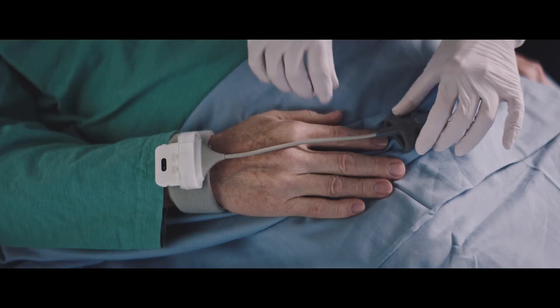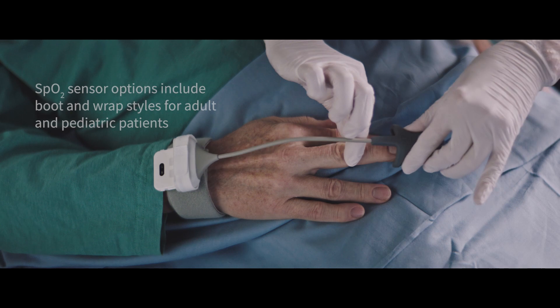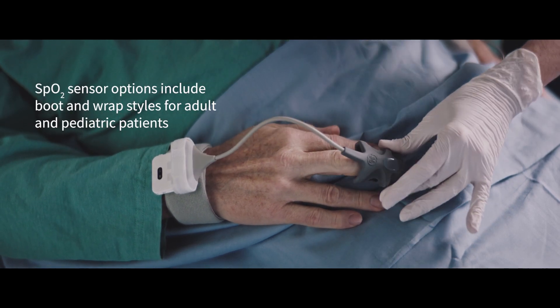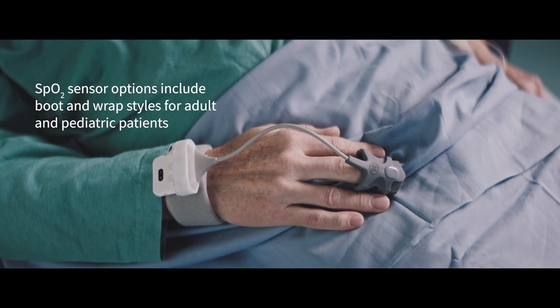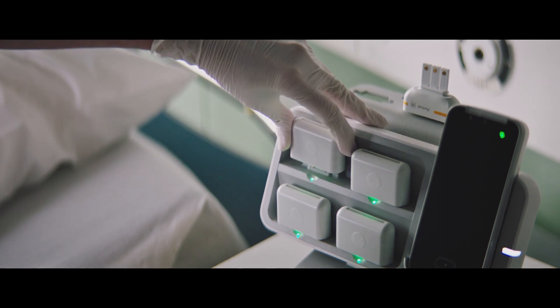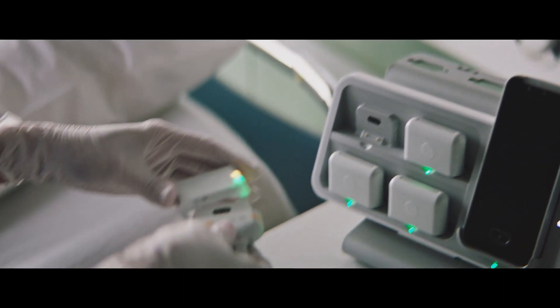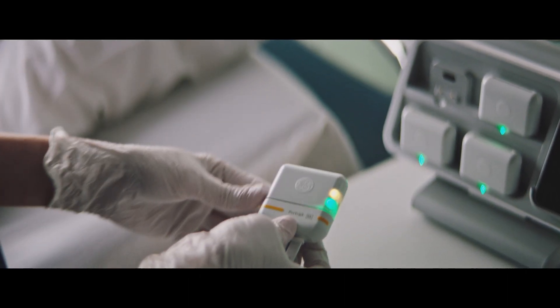Next, the nurse would connect the SpO2 sensor to the patient's finger and secure the sensor to the patient's wrist. The nurse can then attach the sensor batteries to both the respiration rate and SpO2 sensors.